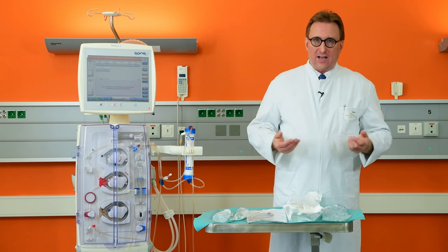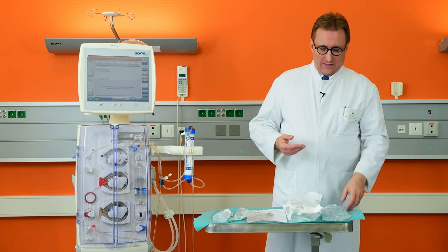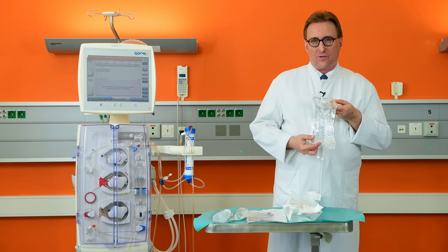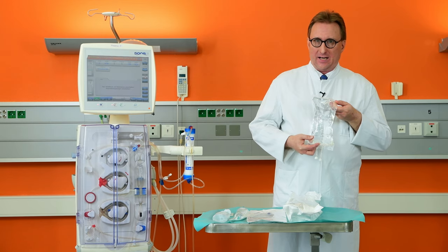In order to flush the filter, you either need one liter of sterile saline, or you use the priming procedure of the dialysis machine with online dialysate.